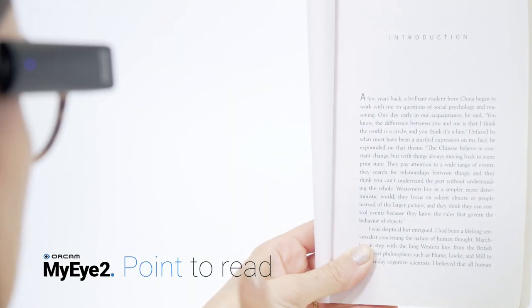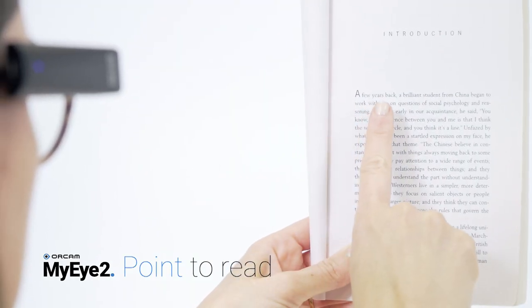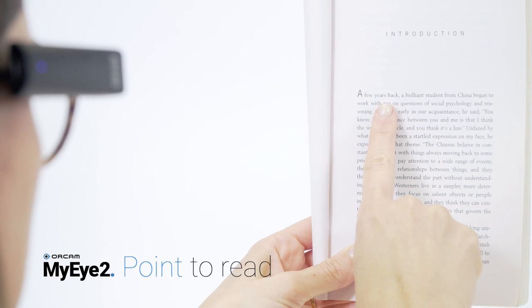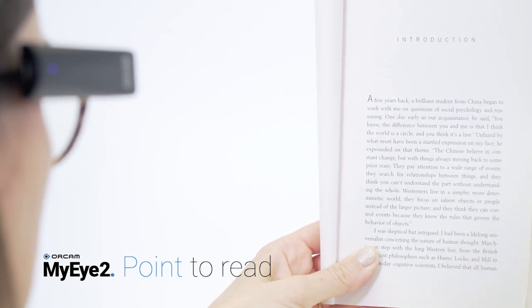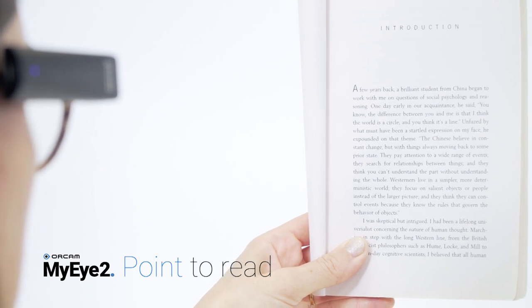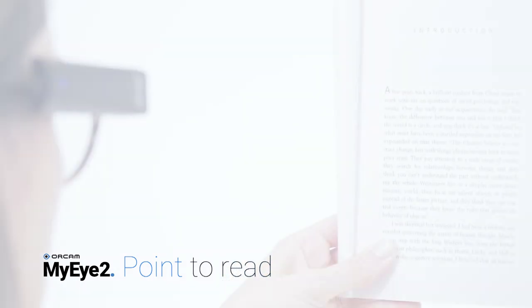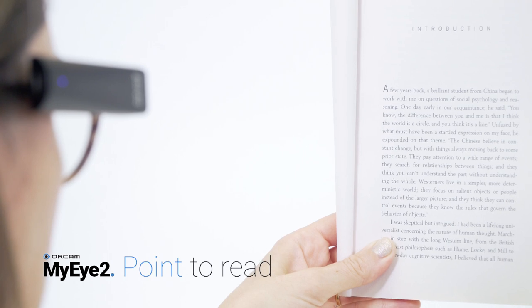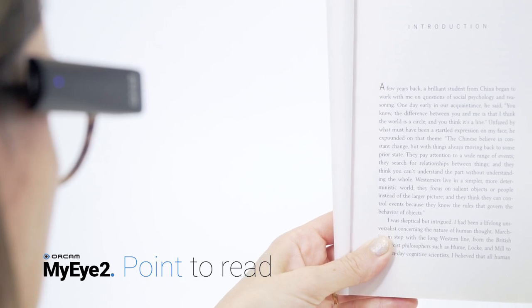Point at the text with your pointing finger extended upwards and fingertip facing the page. You will hear a double beep sound indicating your finger has been detected. Remove your hand from the text so the camera can capture it. Now your device will read the text to you from the top of the section to which you have pointed.